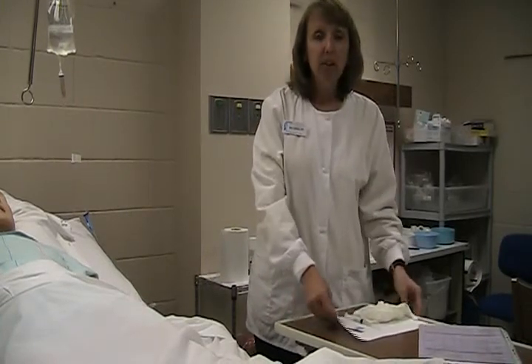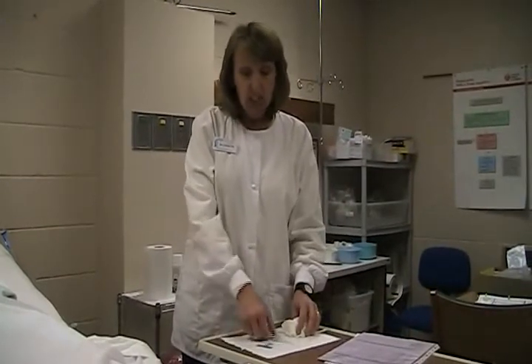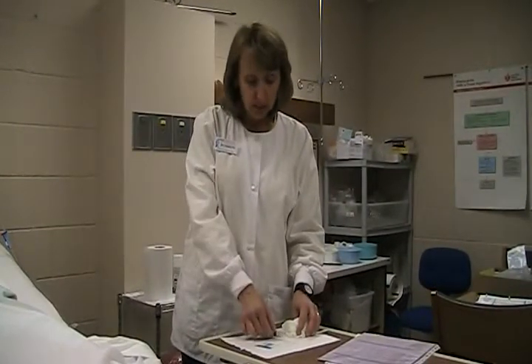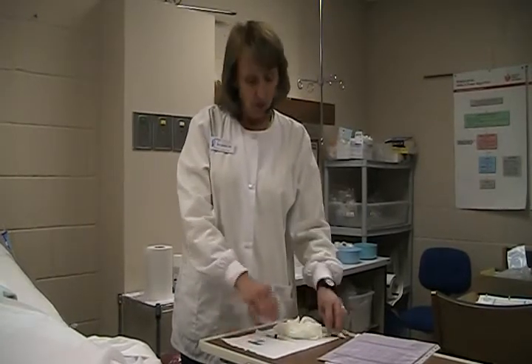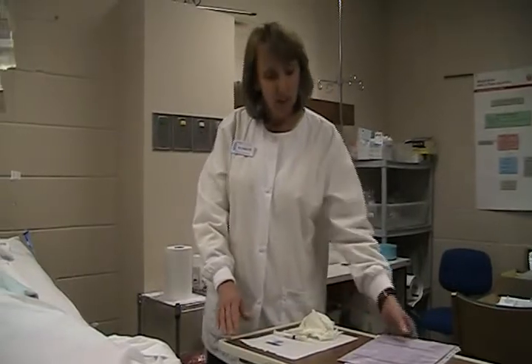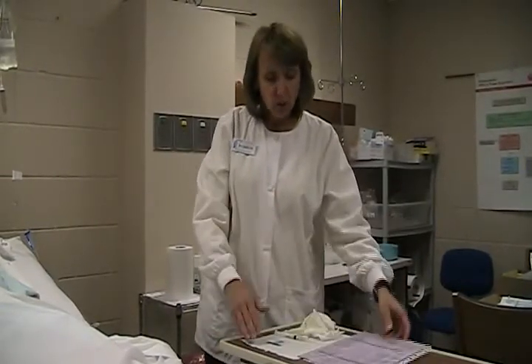After that has been prepared, return to the patient's room, again with your med order, your supplies which you'll need, your syringe that's been labeled with the medication, an alcohol swab, and gloves. Remember your universal steps when you get to the patient's room: hand washing, privacy, body mechanics, etc. Remember also to use a barrier in between anything you bring in the room and setting anything down on the patient's bedside table.